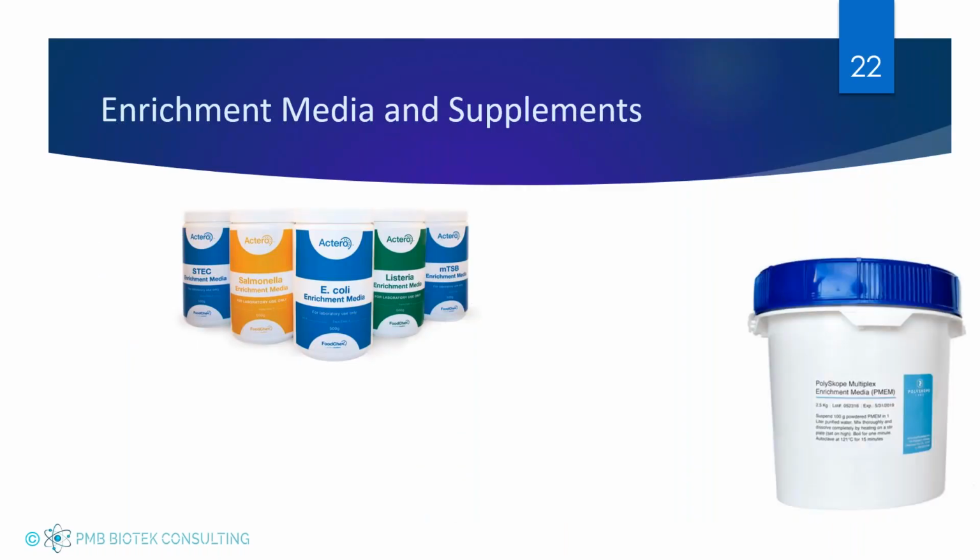Well, really the first thing that companies are looking at is enrichment media. So when we talk about this, your general medias, your tryptic soy broths, your buffered peptone waters, they're specially designed to grow everything.